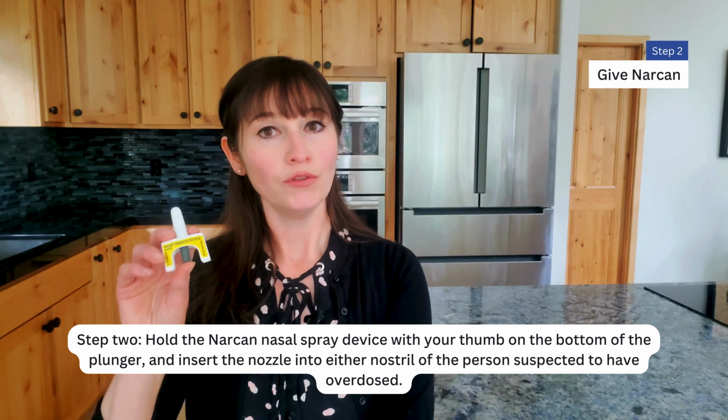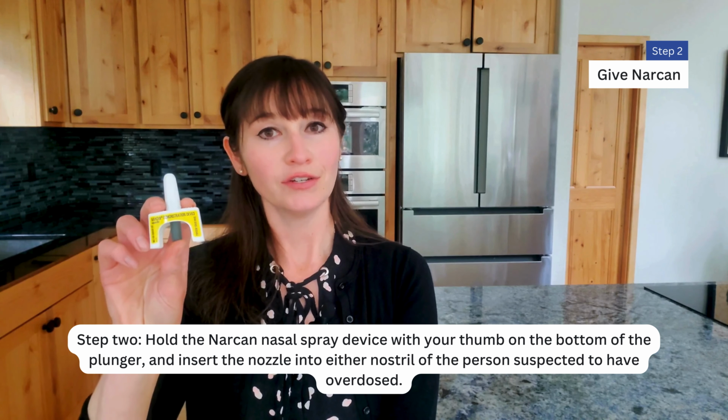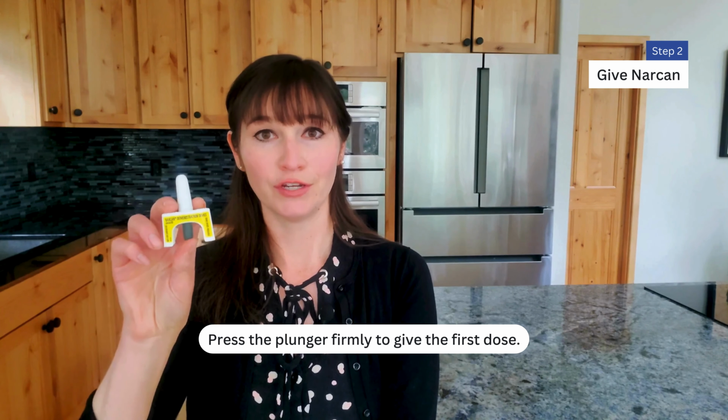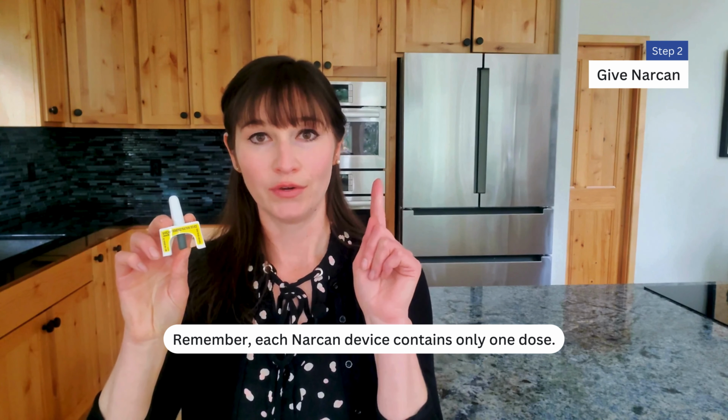Step 2. Hold the Narcan nasal spray device with your thumb on the bottom of the plunger and insert the nozzle into either nostril of the person suspected to have overdosed. Press the plunger firmly to give the first dose. Remember, each Narcan device contains only one dose.